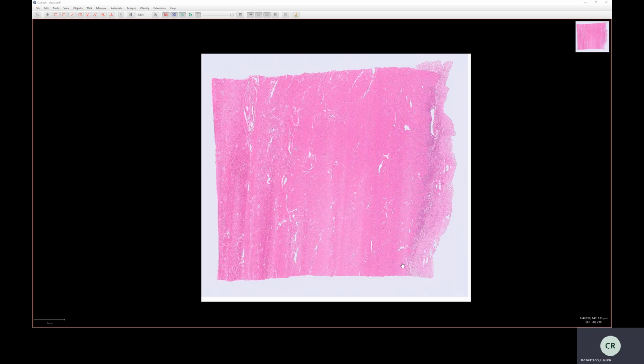There is a basal layer, or the stratum basalis, which is at the bottom, and that is the layer that is constant. It doesn't tend to change very much during the ovulatory cycle, or the endometrial cycle, and doesn't get shed. It's constant. And then above that, towards the luminal side, is the functional layer, or the stratum functionalis, and that is the layer that will change during the cycle and will get shed off during the menstrual phase.